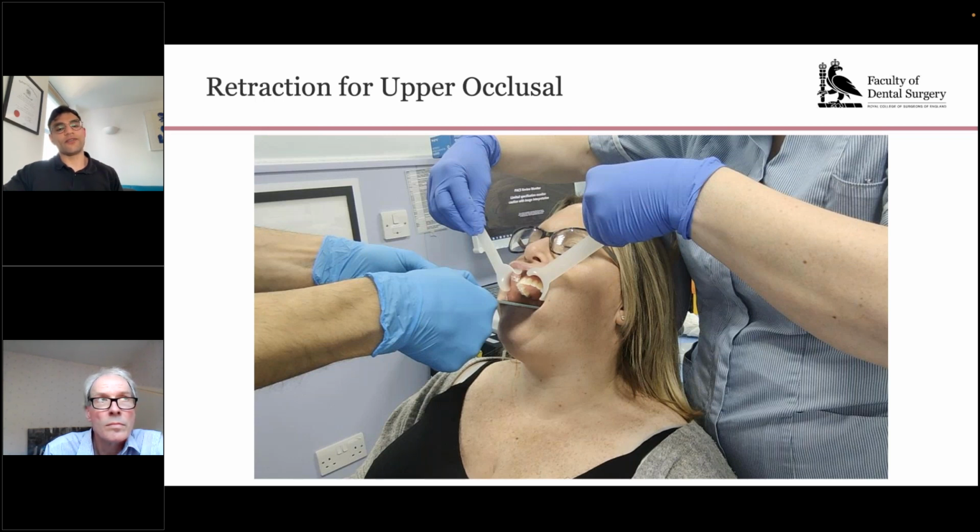I think a twin flash often gives you better illumination. Now, when you use a twin flash with a diffuser, you get loads of diffuse light, which gives you an absolutely gorgeous quality to your photographs. The trouble, however, is that they're more expensive, and also because you can move them around, and you should move them around when you're taking the different intraoral photographs, there's more moving parts and there's more things to play around with, so it's harder to then teach another person how to do that.